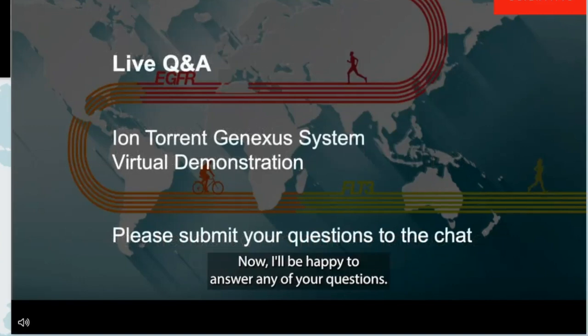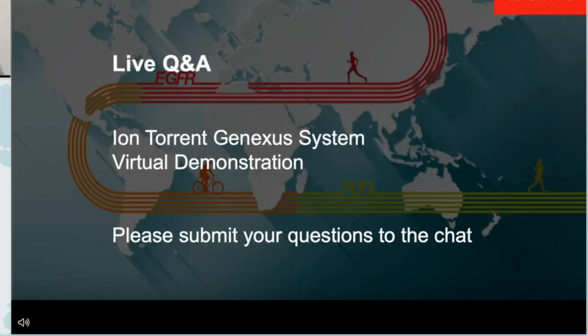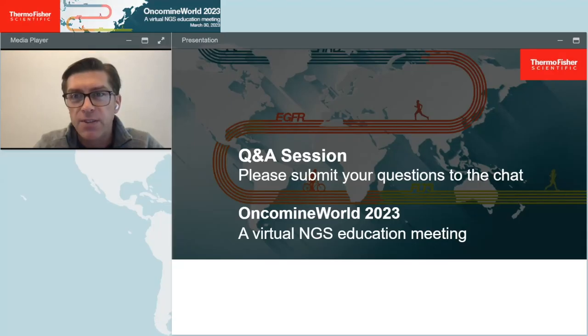Now, I'll be happy to answer any of your questions. I'd like to remind everyone that on the last slide of that presentation, we did note that we do have support for new languages in that Genexus virtual environment. So if you were having trouble walking through the English version of that, there are more languages to walk you through it now. Let's get to some of the questions.